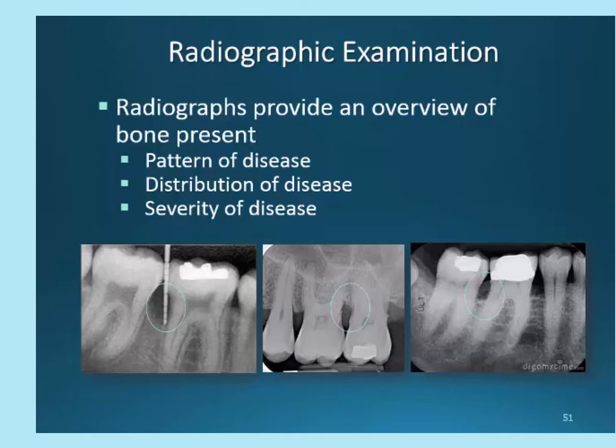When doing periodontal charting, we must always have the radiographs with us. If by chance you do not probe a 1 millimeter increment around a tooth, you may have missed an area of vertical bone loss. Radiographs can help you in detecting these conditions subgingivally.